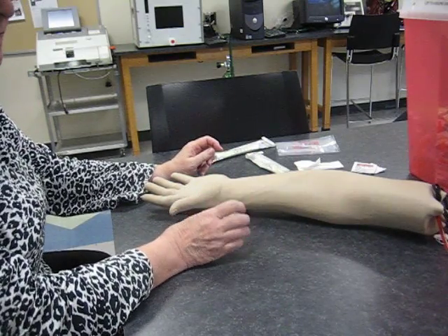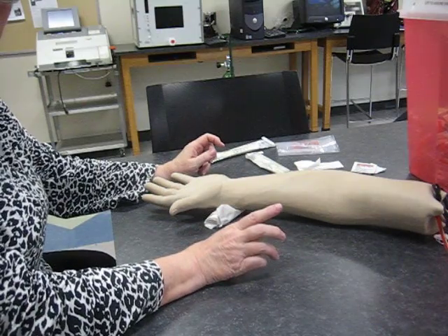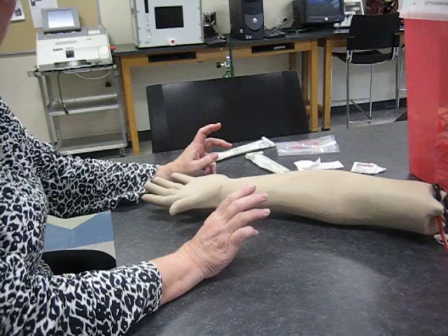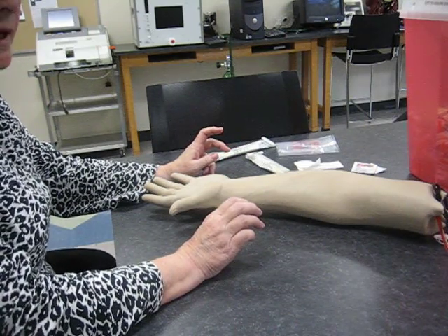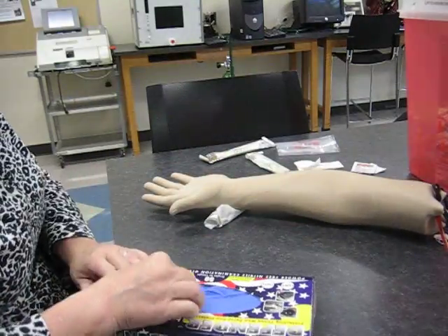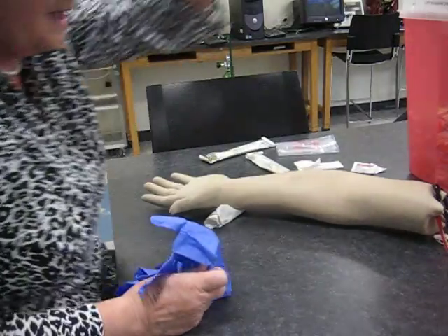This is Mr. Hand and he's in the hospital, he's got a two-liter cannula. I checked 30 minutes ago and he's still on his two-liter cannula — I asked him to keep it on. I'm double-checking with him. I checked his chart and he does not have a history of anticoagulant therapy, he does not have an infectious disease, although it doesn't matter because I treat everybody like they have AIDS, which means I'm going to put on my gloves after I wash my hands.